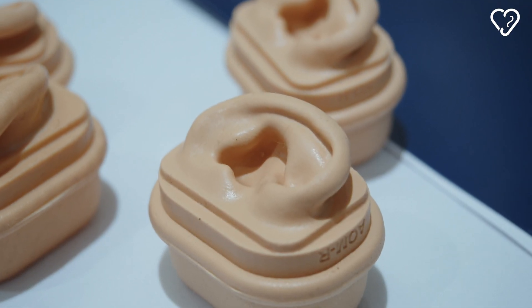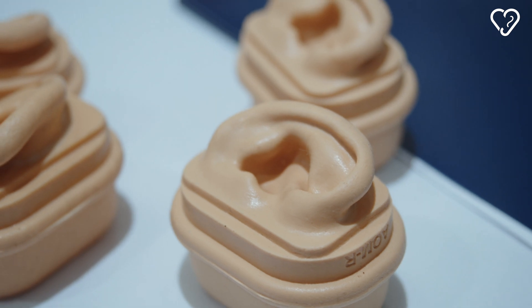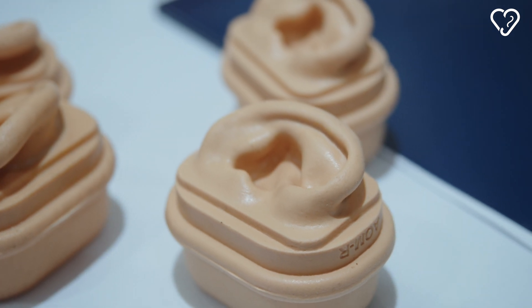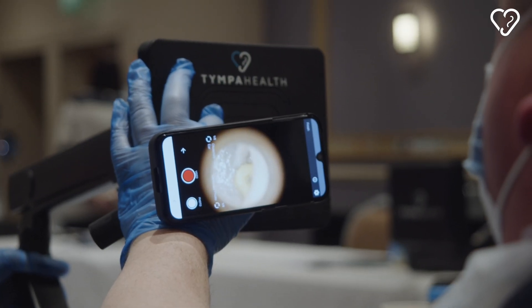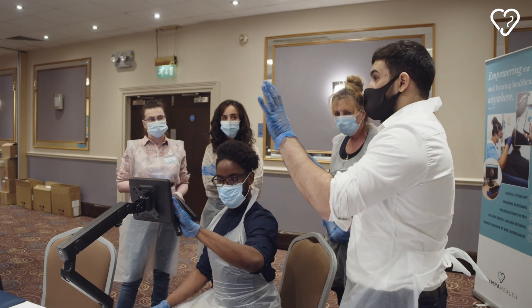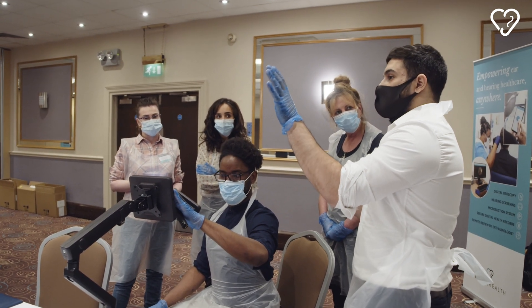These simulated heads are so special because not only are they anatomically accurate, but what we've been able to do with them is make the tympanic membrane itself look realistic. Hand painting means we can make interchangeable tympanic membranes, so different abnormalities can be presented and students can in real terms identify what's normal, what's not — and that gives them confidence in their otoscopy skills.